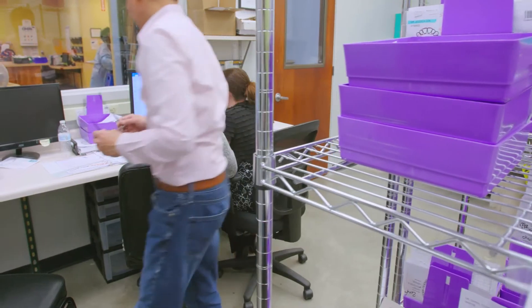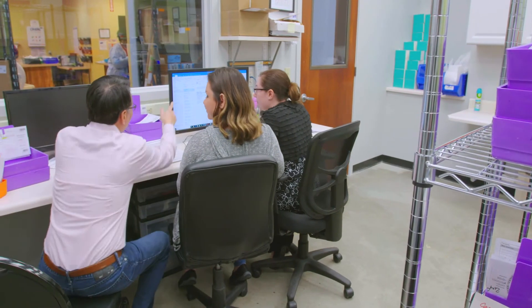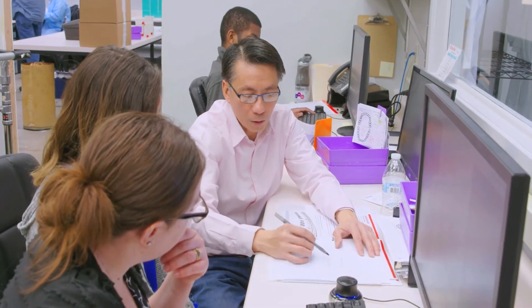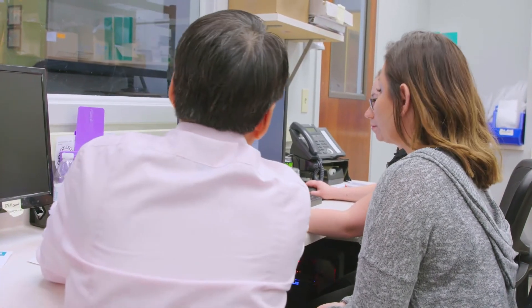Seven years ago we were the first orthodontic lab to take digital scans from orthodontists' intraoral scanners and print the models for orthodontic appliances. Through this astronomical growth of 3D and digital printing and digital models — we call it DFT, digital file transfer — we knew that we were going to have to have 3D printing capabilities that could handle this type of growth.